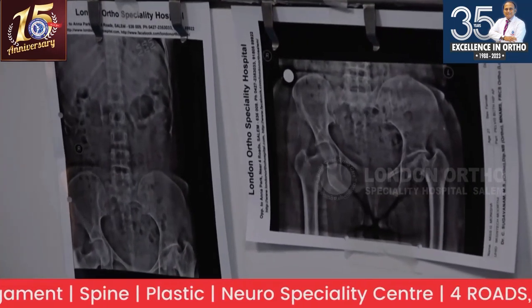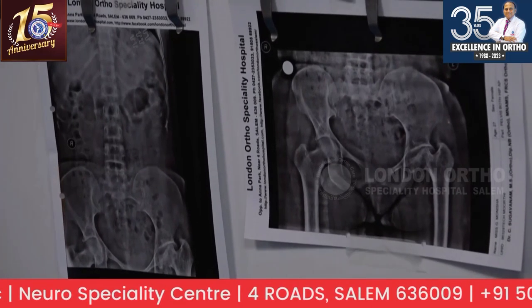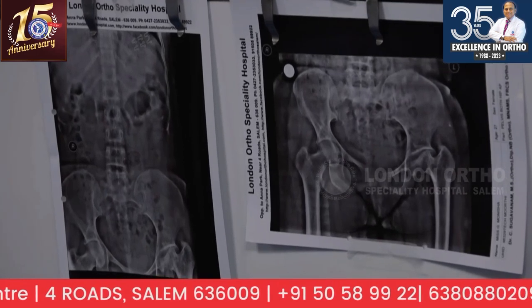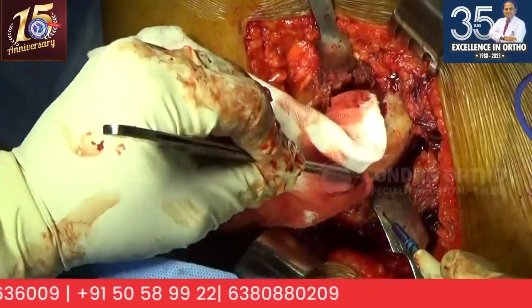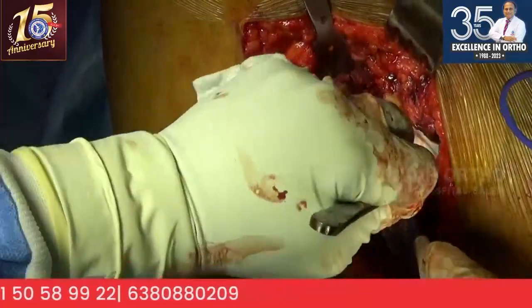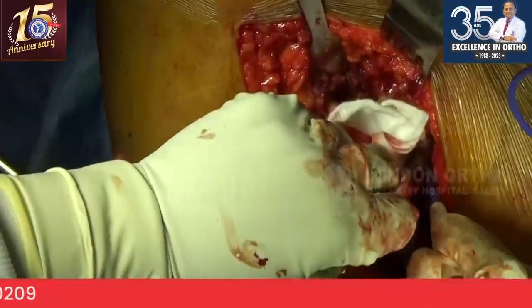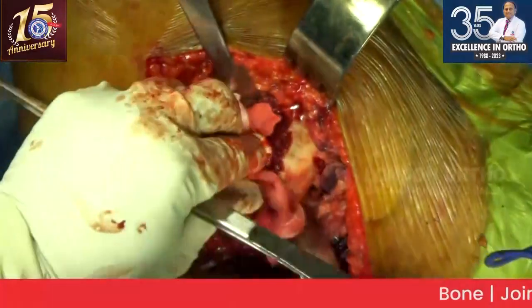So in 80% of the people, the head center will correspond to the tip of the GT. Some people will be above, some people will be low. In this patient, because it is lower on the other side, it's an advantage that you don't have to do too much about that. You just need to put a correct stem, do the standard things, and things will fall into place in this patient, I think. There's no need to do anything out of the ordinary here.